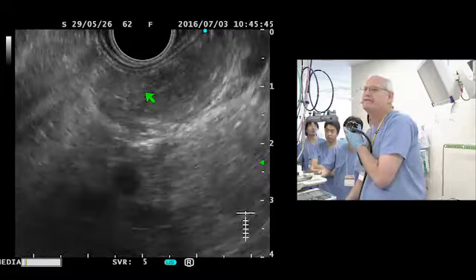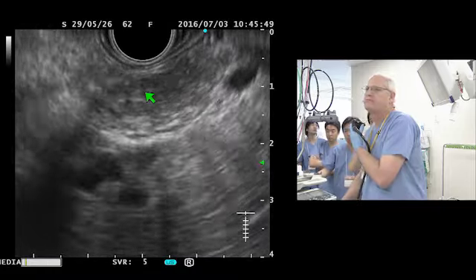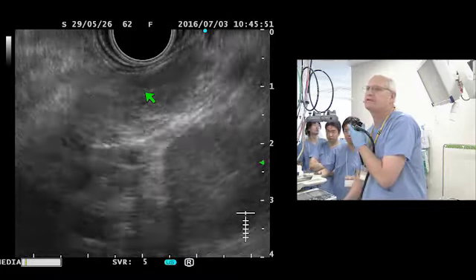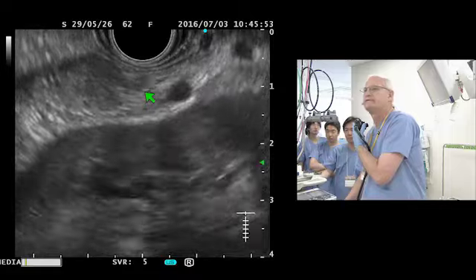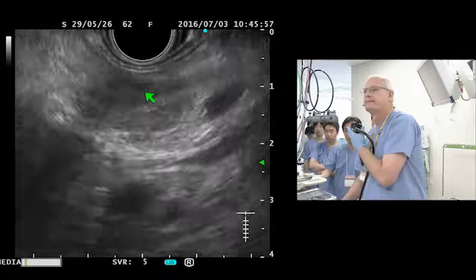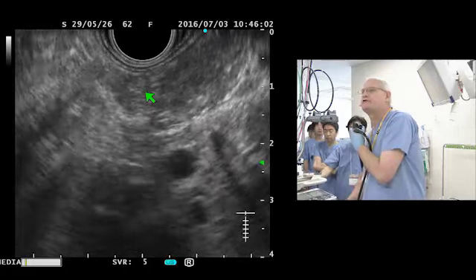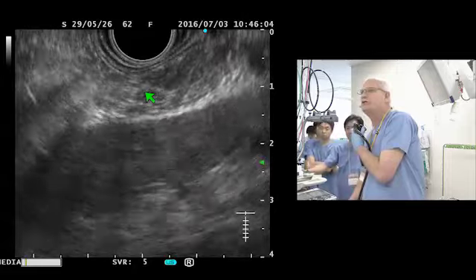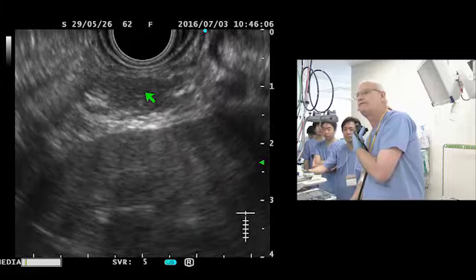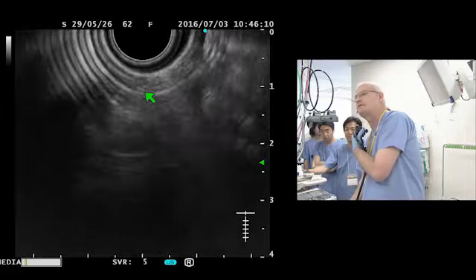I haven't yet found a good image of the main pancreatic duct. I suspect that it will be very irregular if I can find it. But I believe that I am building a picture of the EUS supporting the findings on the ERCP, that of chronic pancreatitis.